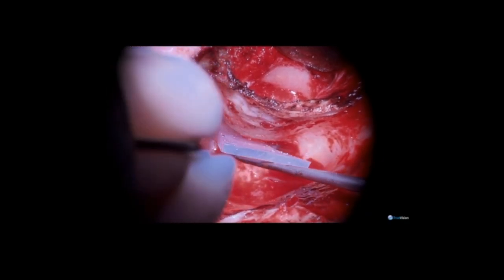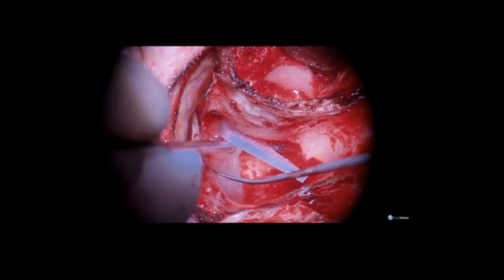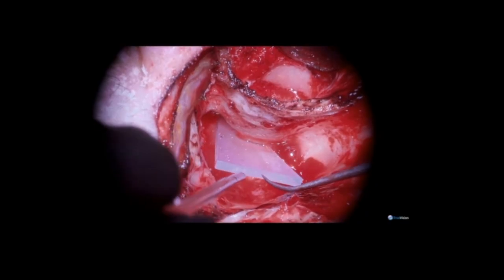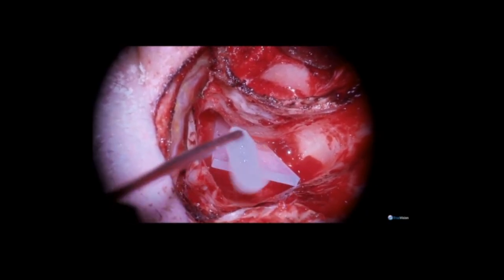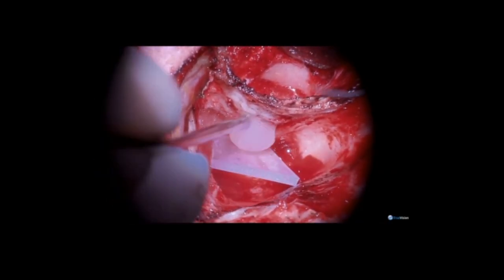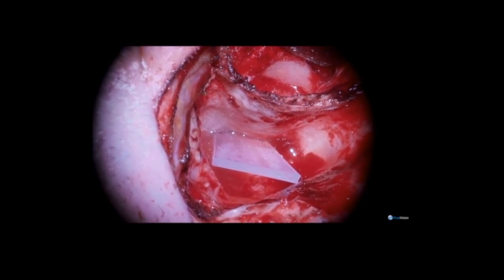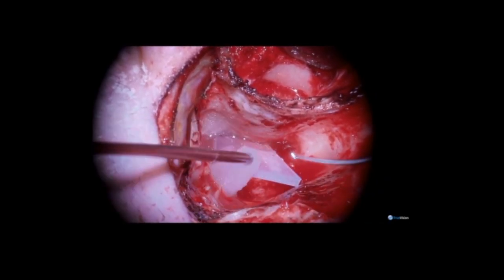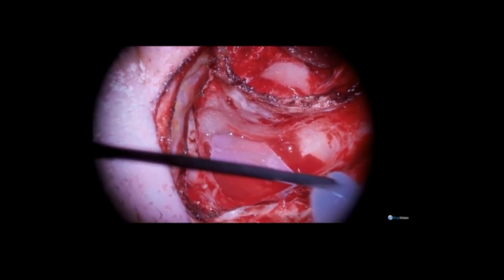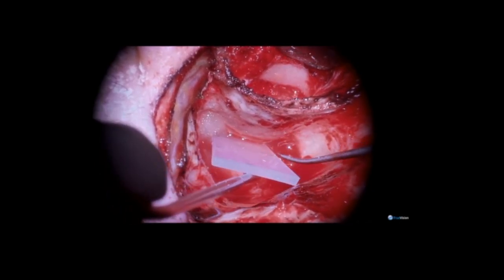Then I will place additional gelatin-based packing material through the mastoid to lift and support the silicone so that it is flush with the undersurface of the bony remnant and support the cartilage. This will optimize the depth of the new middle ear cavity and minimize scarring as well. While doing this maneuver, it is important to keep in mind the position of the stapes and be gentle as not to dislodge or sublux it.